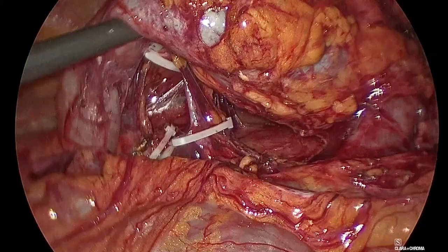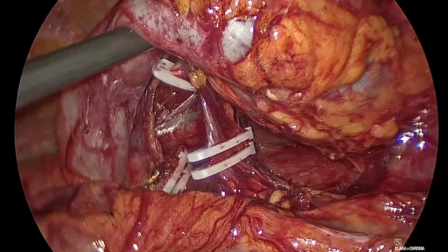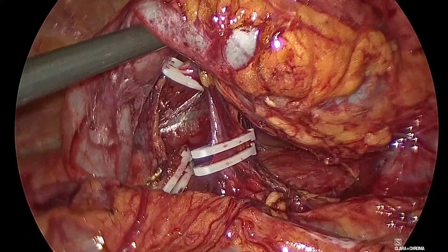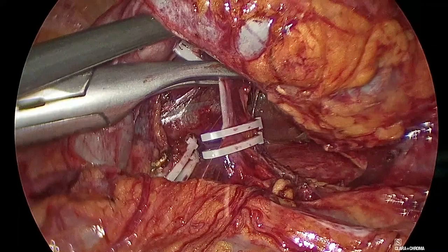I'm sorry for the interruption, but yes, so we were saying lymphadenectomy. Patient 75, negative CT scan. Would you do it, would you not do it? And you said yes. And then you have to tell me, though, Marcus, on the right, what template you would take, because the blood supply of the mid-ureter is coming from the mid-aorta and maybe from something on the proximal renal artery. So certainly the hilar lymph nodes, but then would you also go inter-aorto-caval?